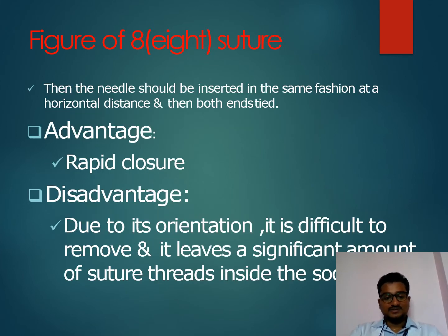Then the needle is inserted in the same fashion at a horizontal distance and both ends are tied up. Advantages: rapid closure. Disadvantages: due to the orientation, it is difficult to remove and it leaves a significant amount of suture thread inside the socket.